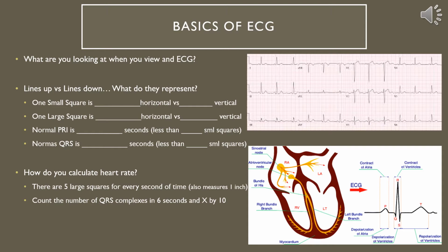So having a basic understanding of reading EKG is important. EKG can help diagnose disorders, and really that's what we're going to be surrounding over the next several lectures. Using a 12-lead EKG as a tool for searching for clues to narrow those differential diagnoses is really what we're aiming to do.